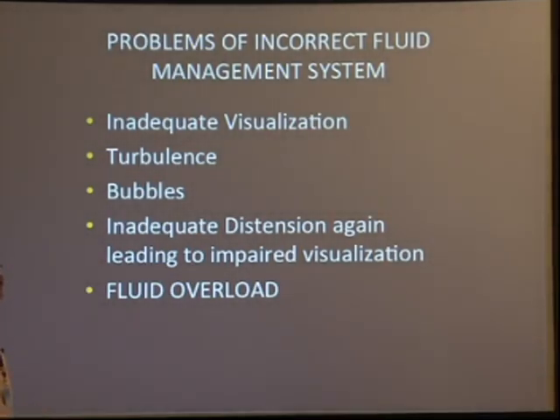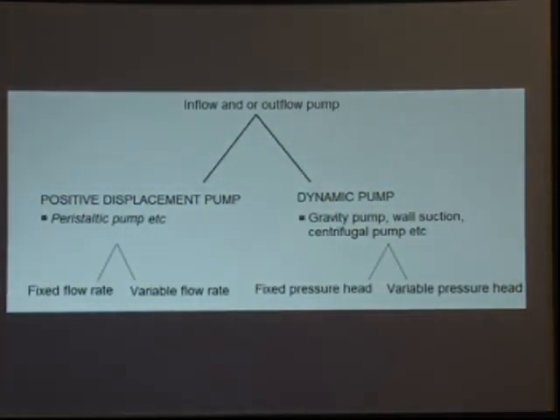So these are the problems with incorrect fluid management systems. You get inadequate visualization, you get turbulence, you get bubbles, you get inadequate distension again and again, leading to impaired visualization, and of course fluid overload. Again, this is Atul's topic, maybe he'll be a better person to explain.